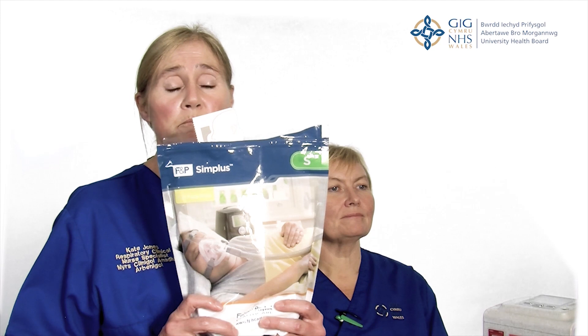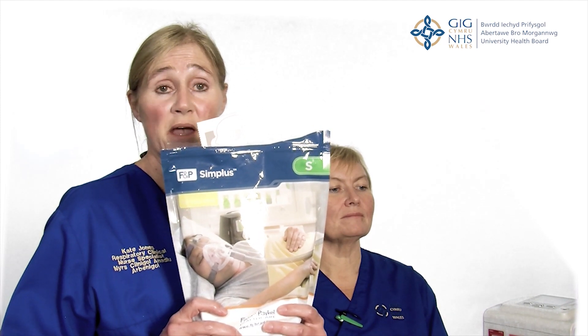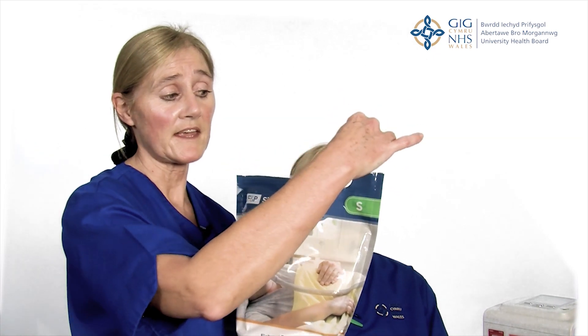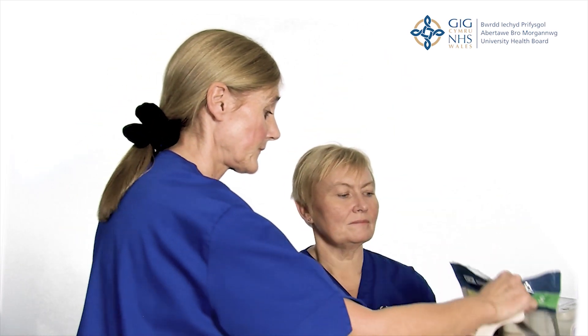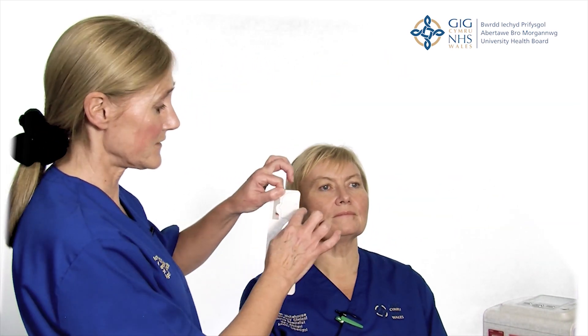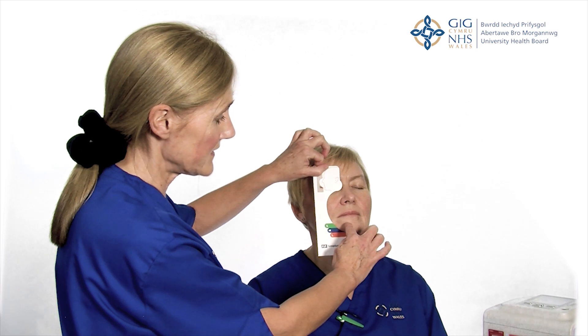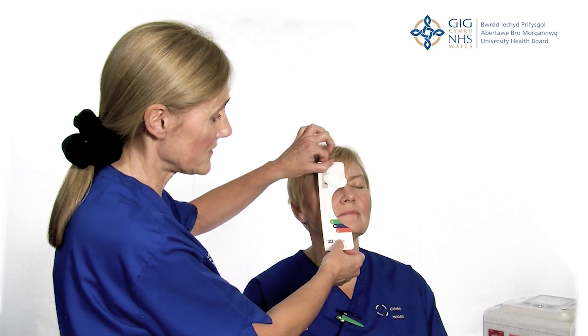So now we're going to do mask fitting and the volunteer today is Karen Whitehouse who's one of the other respiratory nurses here at Morriston. This is the mask we use. It's a Simplus mask and it comes in small, medium and large and it's well tolerated by patients as it's a very comfortable flexible mask. Each mask comes with a measuring tool inside that you just break off from the cardboard and this is how you use it. It's got a round bit here which you place over the eye and then you can see what size — Karen is a small — it corresponds with the groove here in the chin and that's where the mask should fit.